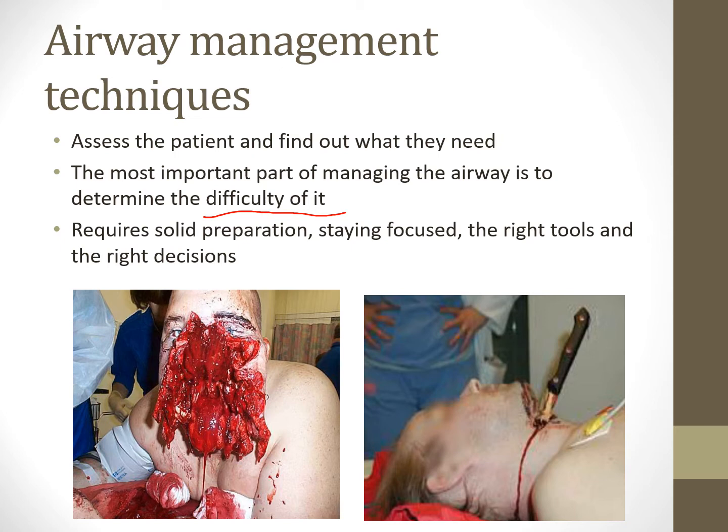And that's what we're going to be doing here. When you have everything available, when you know the situation ahead of you, you're going to be a lot more prepared. You're going to be more calm. You're going to have that calm confidence going into it, and then we'll all have a plan knowing who's doing what in this difficult intubation and where the equipment is and who's comfortable using that equipment, right? So this is all you having solid preparation skills, staying focused, and having the right tools and right decisions ahead of you.